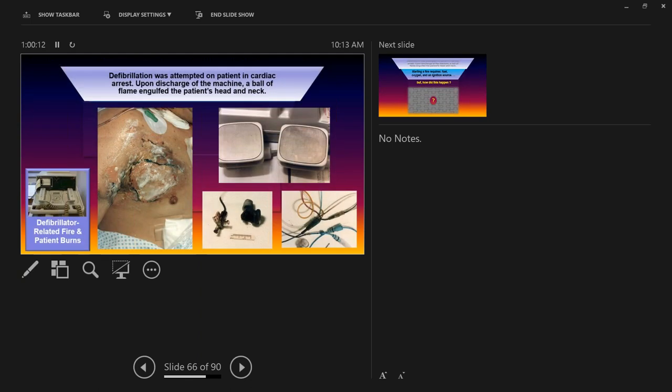they're really crucial. Did you find the time and date stamp matched the correct time and date? It was still correct. But sometimes they'll get a little off. In this case, a few minutes maybe. But for days, if the biomeds aren't checking that, then the event stamps are off too. Good point. Exactly what happens. And it's a little easier to do from the front panel.